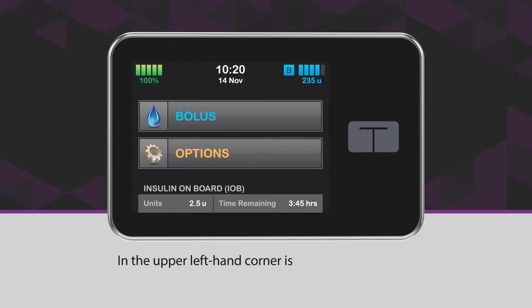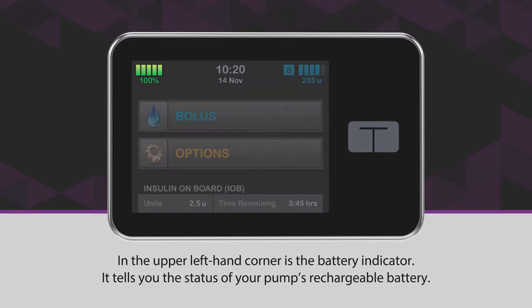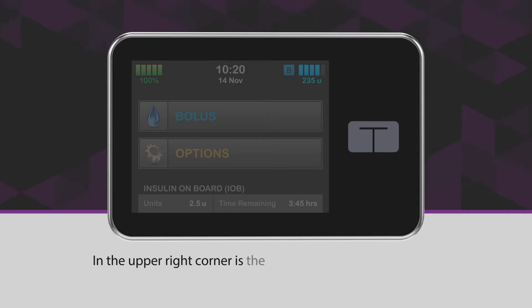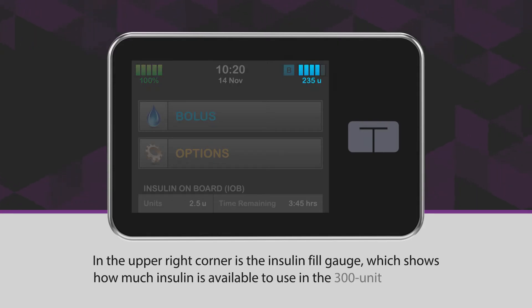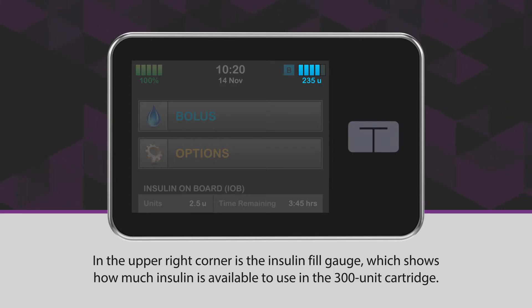In the upper left-hand corner is the battery indicator. It tells you the status of your pump's rechargeable battery. In the upper right corner is the insulin fill gauge, which shows how much insulin is available to use in the 300-unit cartridge.